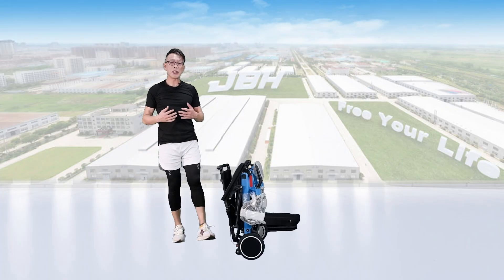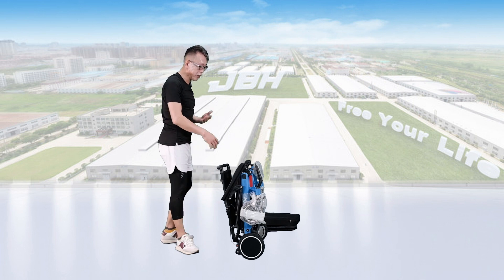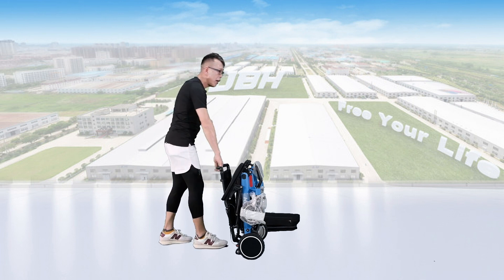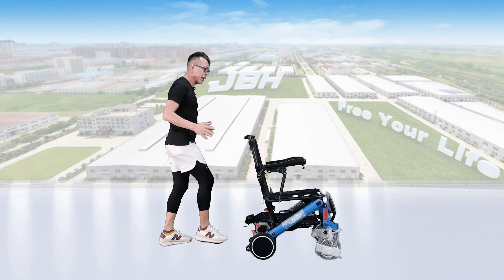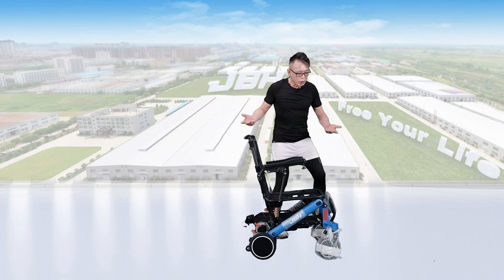Next, let's open up the wheelchair. Just use one hand to hold the top of the seat back, then lean the wheelchair to the front and put the seat back into position. That allows us to open up the wheelchair.